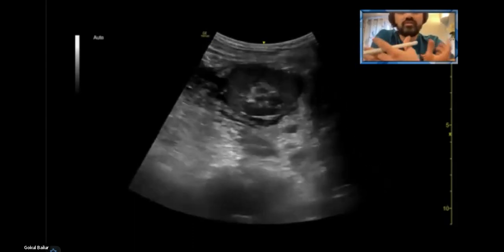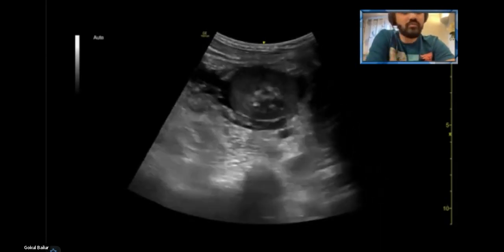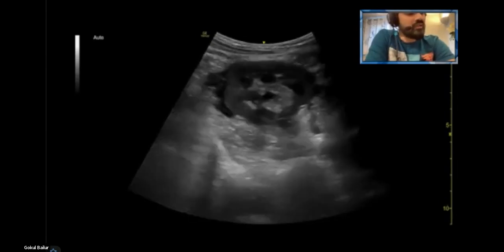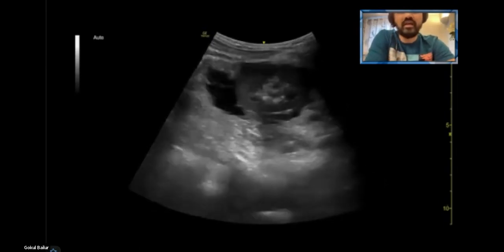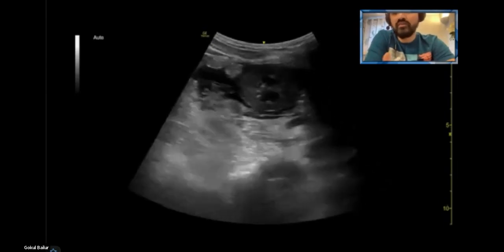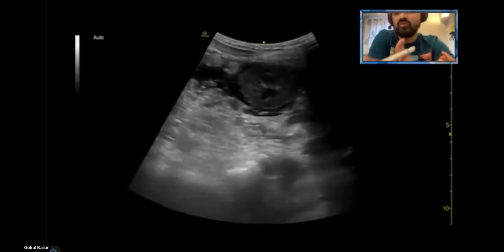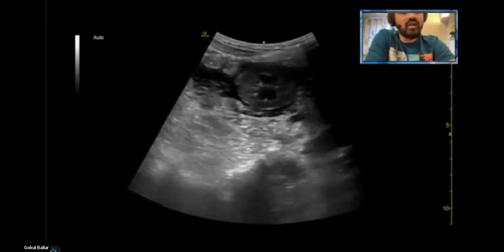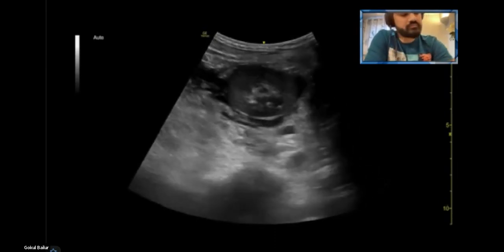But during her stay, she did get a bit unwell, but slowly after the procedures kind of improved and had a good outcome. So I think ultrasound played an important role, especially 9 o'clock in the night. You're not able to get a CT scan. They might have said, okay, your pain is getting better. You don't have a AAA, maybe come back in the next day for a CT scan. So it's a possibility that she might have gotten worse. I think it kind of expedited the care and got her the proper treatment that she required at that time.